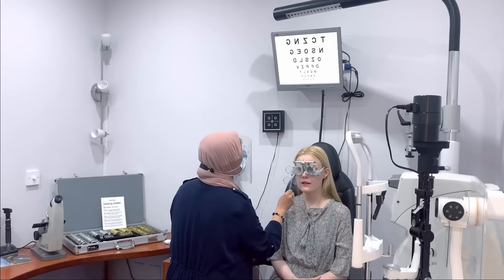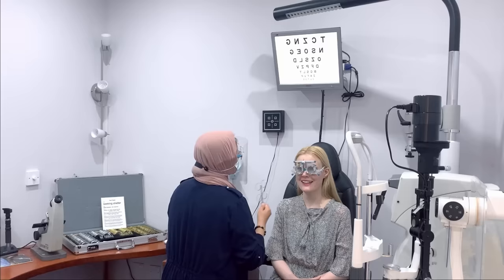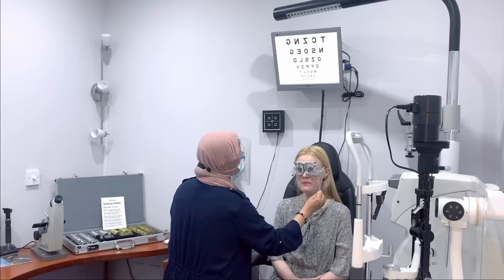I think better without. Without slightly, yeah? It's a subtle difference, isn't it? Yeah, very subtle. So once again, you ready? Okay. Once again, better with or without? Gosh, it might be better with. Slightly better with? Yeah. Good, okay, so I'm just going to change that lens.